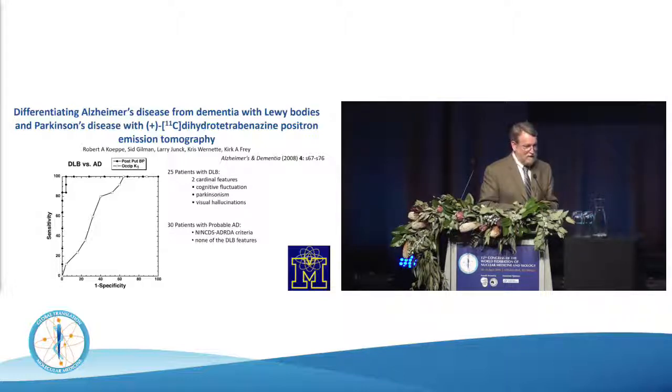And here's an exemplar, although not with ioflupane. This was done in our laboratories years ago using VMAT2 imaging with tetrabenazine. And here we sought to contrast the occipital cortex hypometabolism, in this case hypoperfusion, in separating dementia with Lewy bodies from Alzheimer's disease. And you can see that that's the open symbols here. So that's this curve.